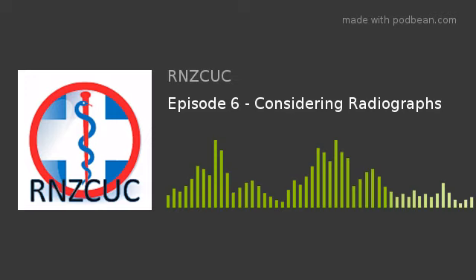So for our clenched fist series, which we also call a dynamic wrist series, it involves your standard wrist series, which is your PA, oblique and lateral, with the additional views of a PA with the clenched fist. The fist is clenched as tight as you can. We also do an ulnar deviation and radial deviation view, and then an extra lateral view with the fist clenched. So they're called dynamic views because we're taking views with the wrist moving in different positions, and it's to demonstrate any abnormal widening around the scapholunate joint.